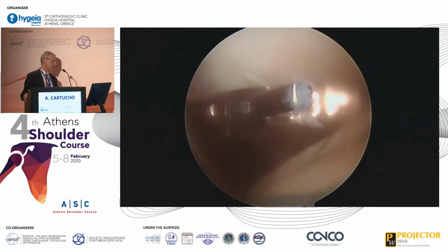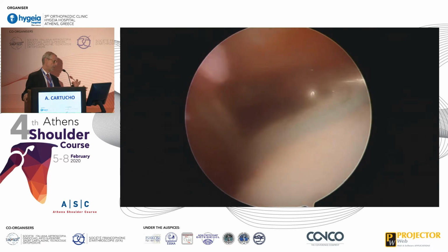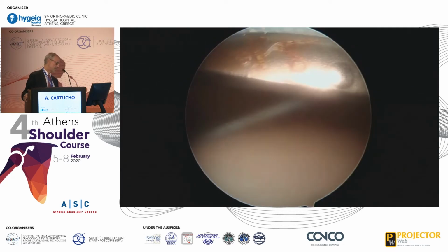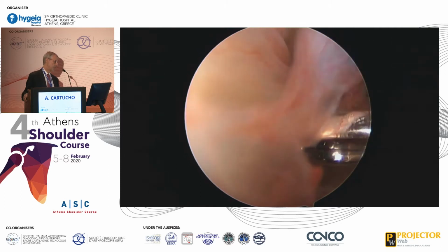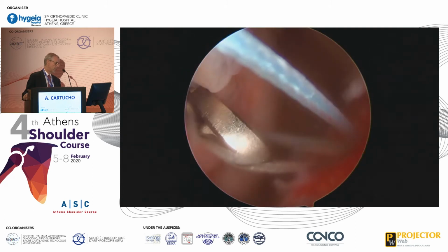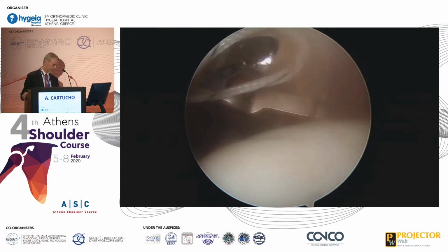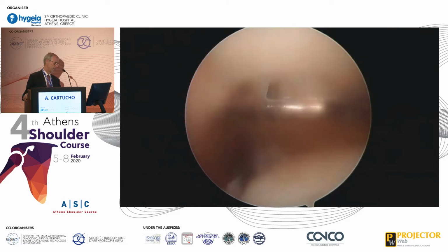Then, as you can see, I do for the beginning a lazy stitch with 2 strands, and I put my cannula in the back of the capsule, so you cannot see the labrum, the cannula here. My cannula is outside the capsule, and then I repeat my gestures in order to make like a parachute with my strings, as you can see here. I try to be very careful when suture managing. As you can see, I'm going around the other white one in order not to be tangled here, and in order to have sliding knots at the end. Sometimes it doesn't happen, but you have to be careful on that.